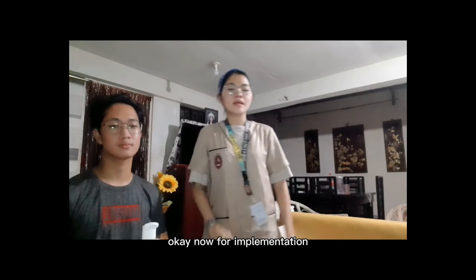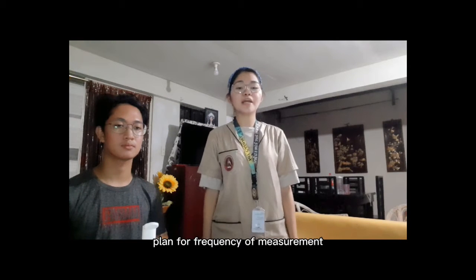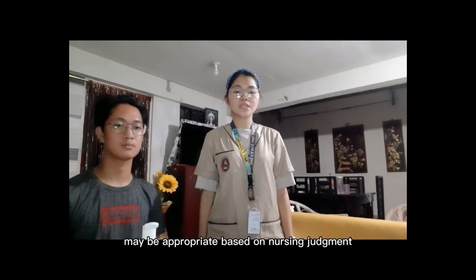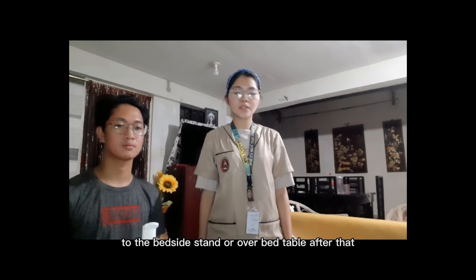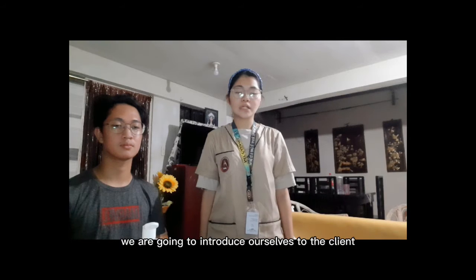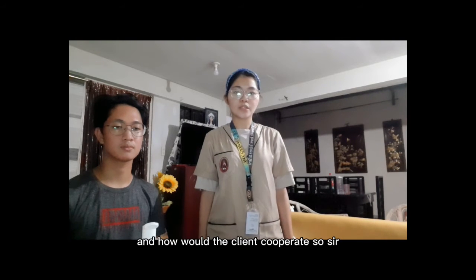Okay. Now, for implementation, we have to check the medical order or nursing care plan for frequency of measurement and route. More frequent temperature measurement may be appropriate based on nursing judgment. Then we have to bring necessary equipment to the bedside, stand, or overbed table. After that, we are going to introduce ourselves to the client, what we are going to do, why it is necessary, and how the client can cooperate.